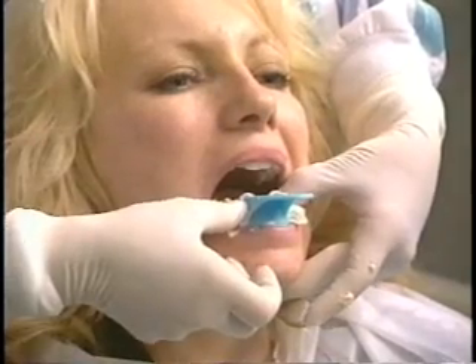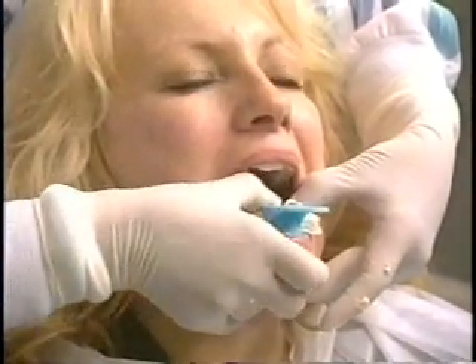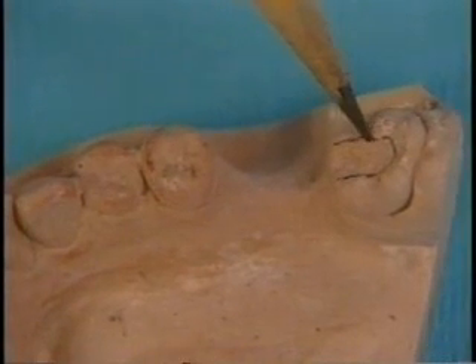Be sure to take a counter impression, bite registration, and shade. The following procedures can be accomplished in the laboratory.